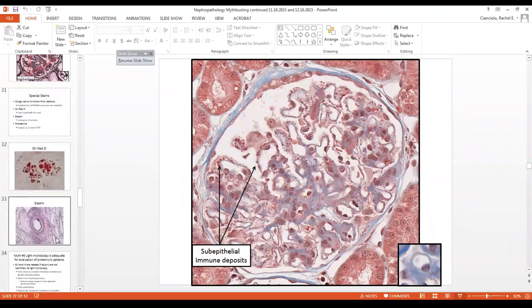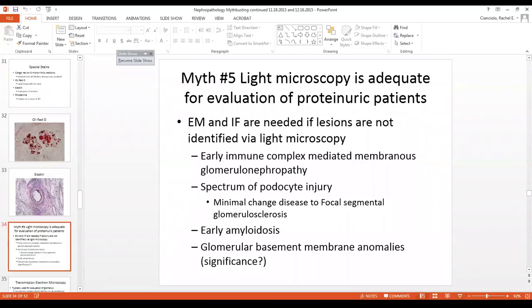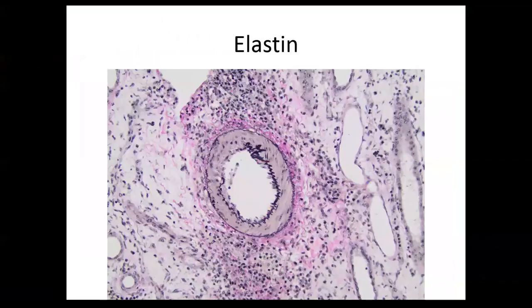I don't know to what degree they do, and that is actually going to be the summer research project that I'm going to have a vet student help me with. So I'm going to do serial biopsies of dead things to look at how much, and this is a great example of tubular separation. Like this tubule is here and this tubule is all the way over here. That's way too much interstitial matrix. So I'm going to try to do a little bit of a time course analysis, because maybe that's a better way for us to judge tubular injury than always looking at brush border.